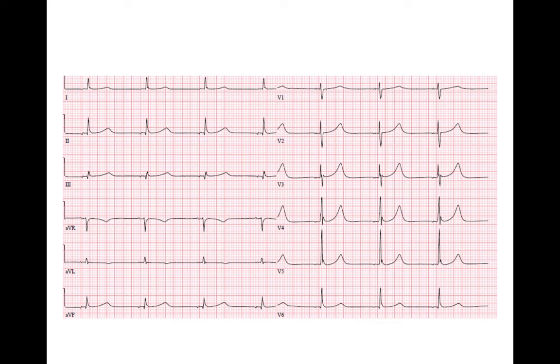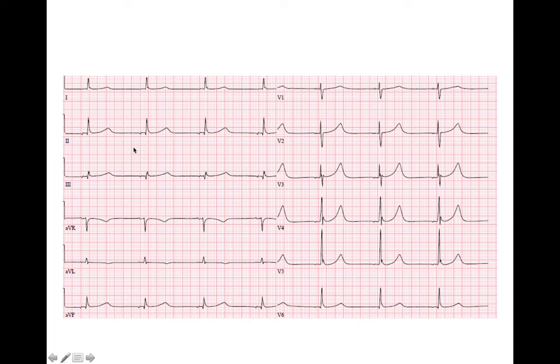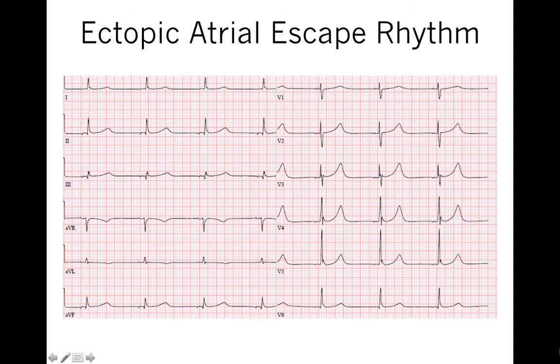Please interpret this ECG — pause the video and we will answer and explain after. For this particular ECG, the patient is bradycardic with a heart rate of less than 50 beats per minute. There is no sinus P wave; the axis of this P wave is abnormal — it is isoelectric in lead 1 and negative in lead 2. So we have a diagnosis of sinus node dysfunction with an atrial rhythm coming from a place other than the sinus node. This is called ectopic atrial escape rhythm.